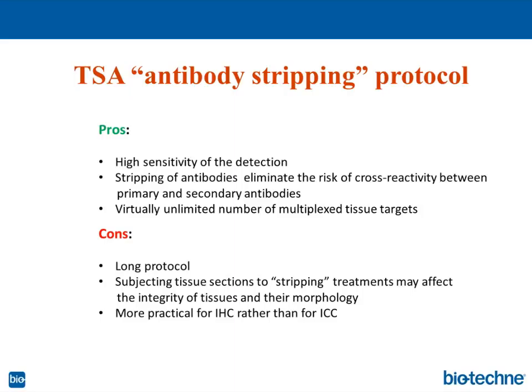There are serious cons to this protocol. The protocol is long and cumbersome. It's tedious, and someone needs to be not a novice, but experienced in doing IHC. Subjecting tissue sections to stripping treatments may actually affect the integrity of tissues and their morphology, which in the end may actually lead to having tissue sections which are absolutely unusable.